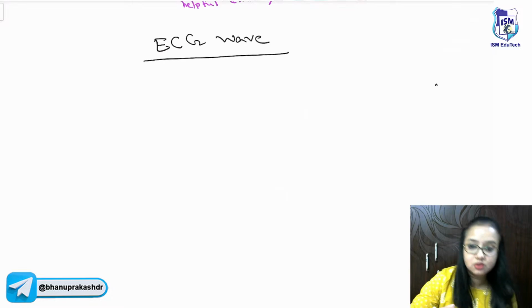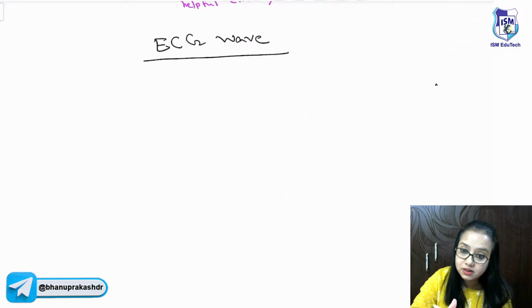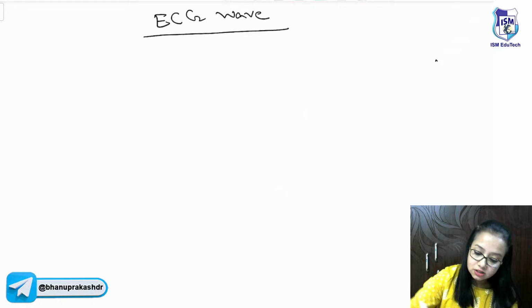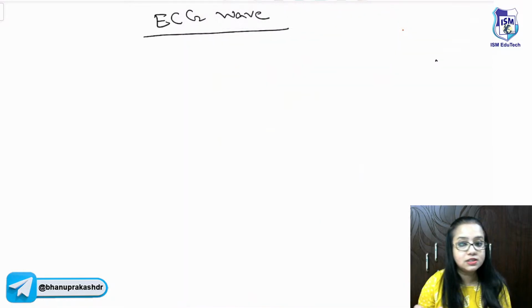Okay, we have understood the lead. Now, what did we mention? What did we study in the last few minutes? That the electrical activity will be reflected on the ECG paper by deflection, by moving of the pen up and down, which will form various waves, right? Now, what are the different types of waves? ECG not only shows the waves, it also shows certain intervals and segments.